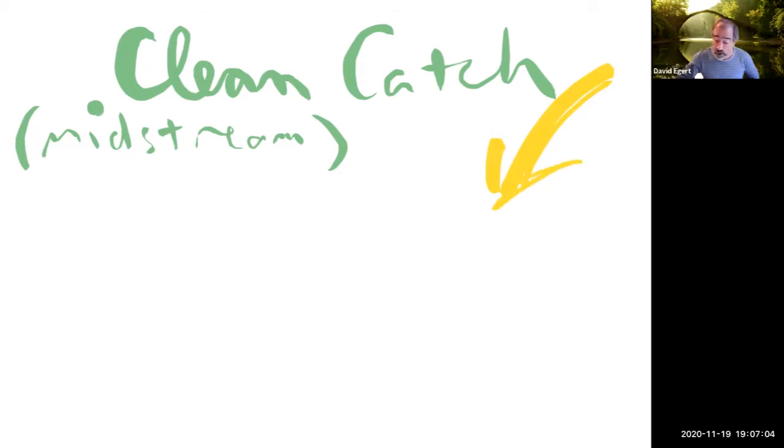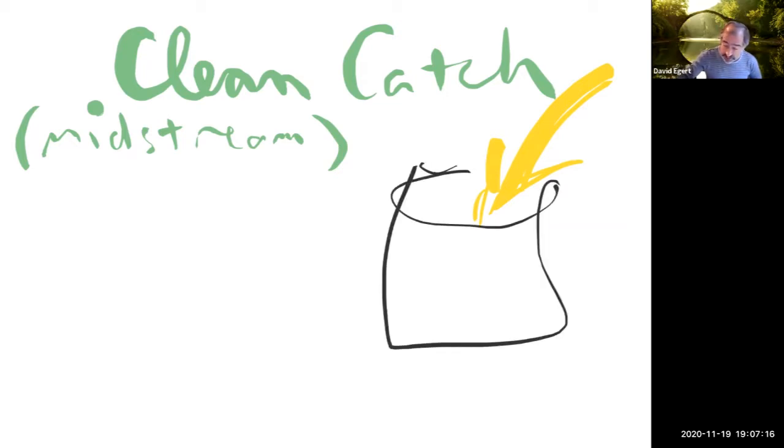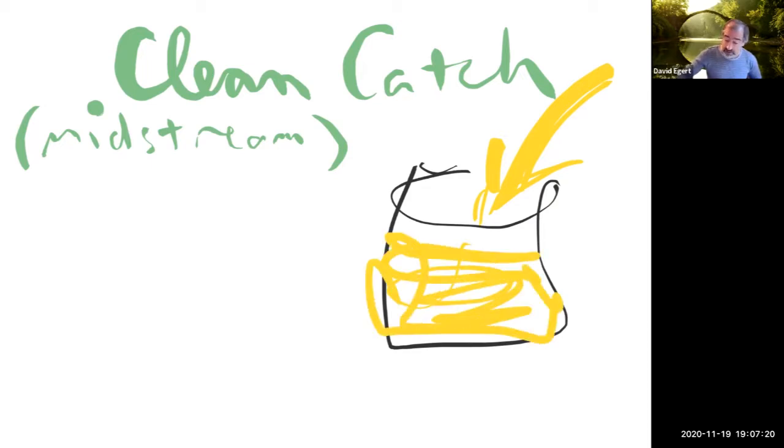So you don't want the initial part of when you start peeing. Instead, you let it clean things out, and then midstream, you put the container there to catch the urine to analyze. That way you're less likely to have contaminants that are going to cause artifacts in your data. So that's what clean catch, or midstream, means.